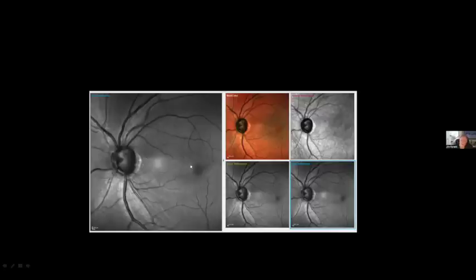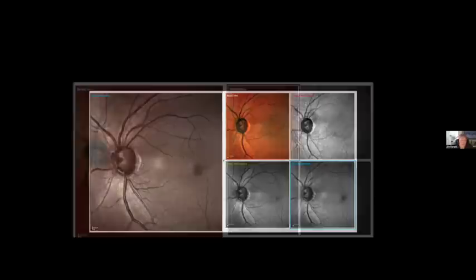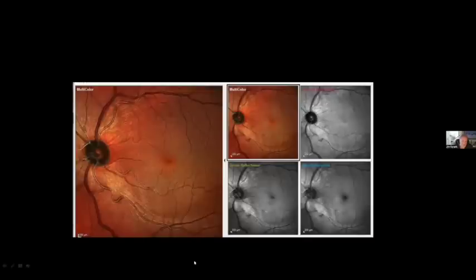And when we see visual field defects above or below, typically those visual field defects originate either in the retina itself or the optic nerve. And that helps us to localize some of the visual field defects that we see from a neuro-ophthalmic perspective. And this patient, interestingly, we can see a rather small wedge defect much further away from the optic nerve where we typically see glaucomatous damage.